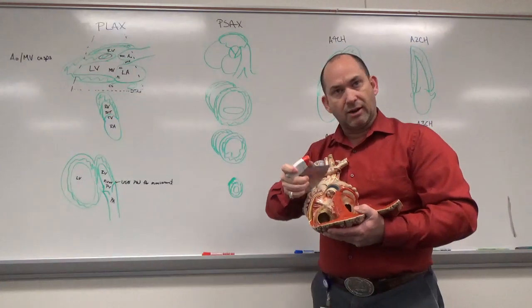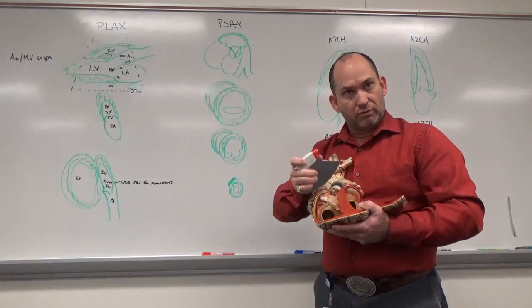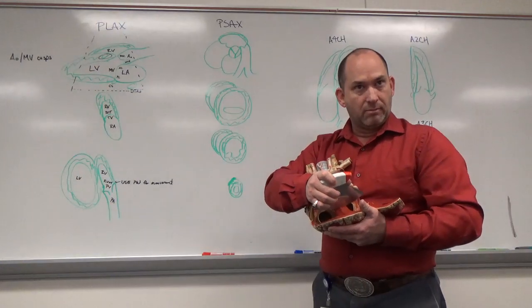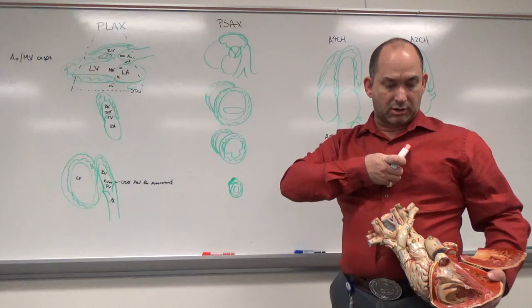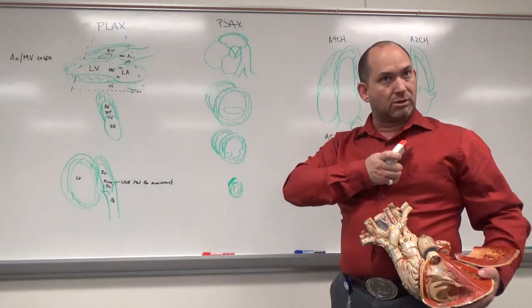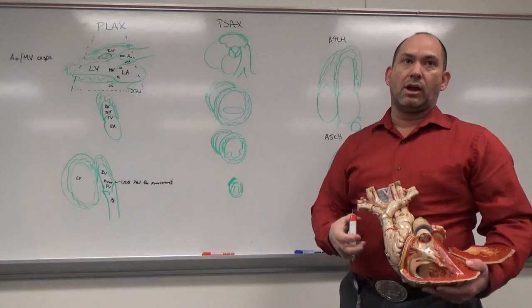We're going to angulate down, or sweep down, out of those valves to the mitral valve level, and then we sweep down or slide down to the mid-ventricle and then to the apex. So when we're here, we're kind of sweeping a little bit on these, but then you might need to slide down and away from the sternum towards where the apex is, and then angulate a little bit until you square that up and get it nice and round for each of these views.